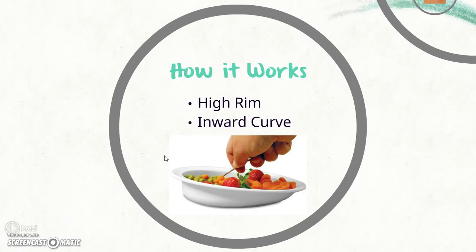The scoop plate works by having a raised and inward curved edge that allows the food to be easily scooped into the eating utensil. It can be used with only one hand, so you don't have to use the other hand to steady the plate while you're using it. Even though it's a relatively simple design, it can be very helpful for clients who eat with only the use of one hand.